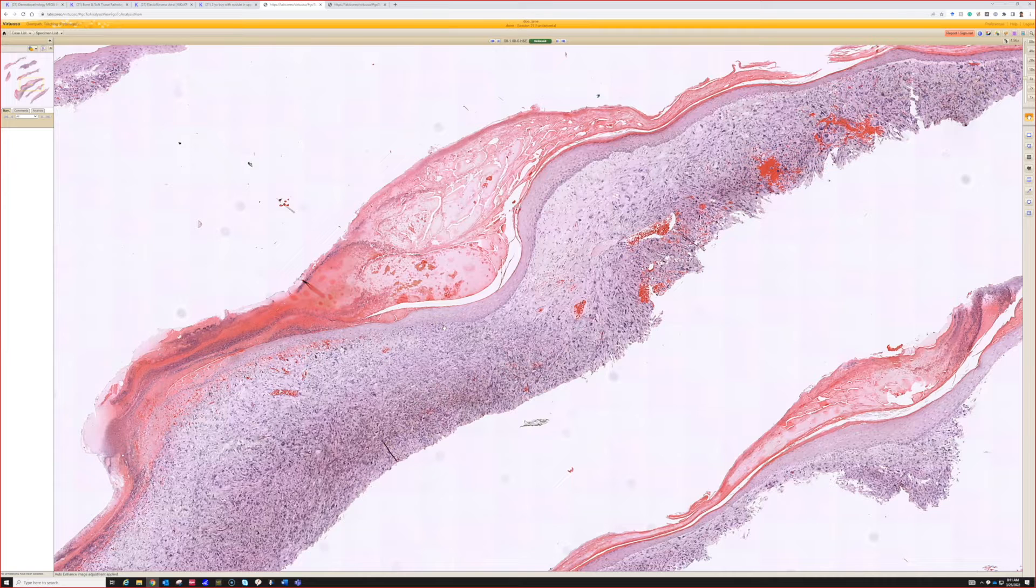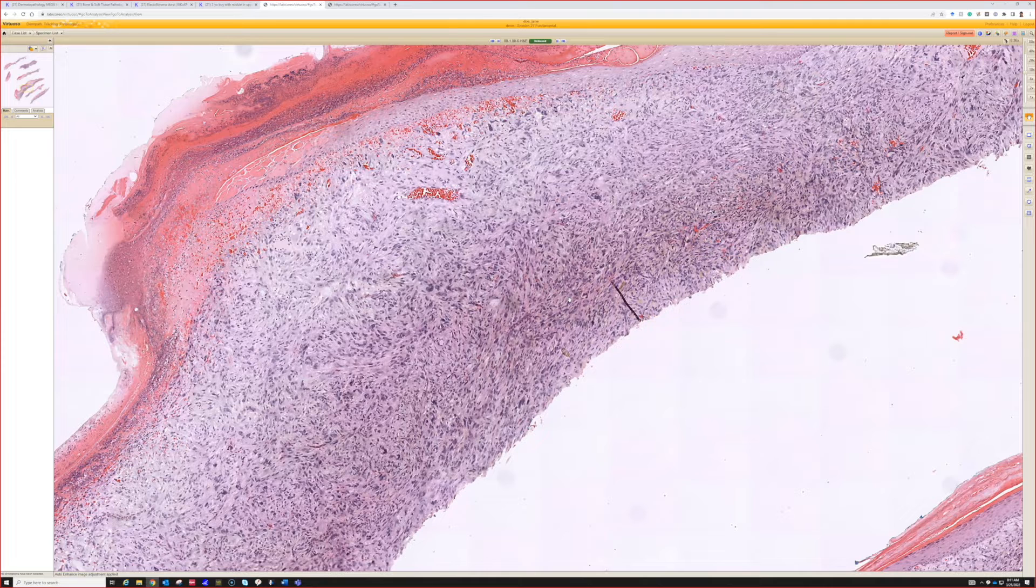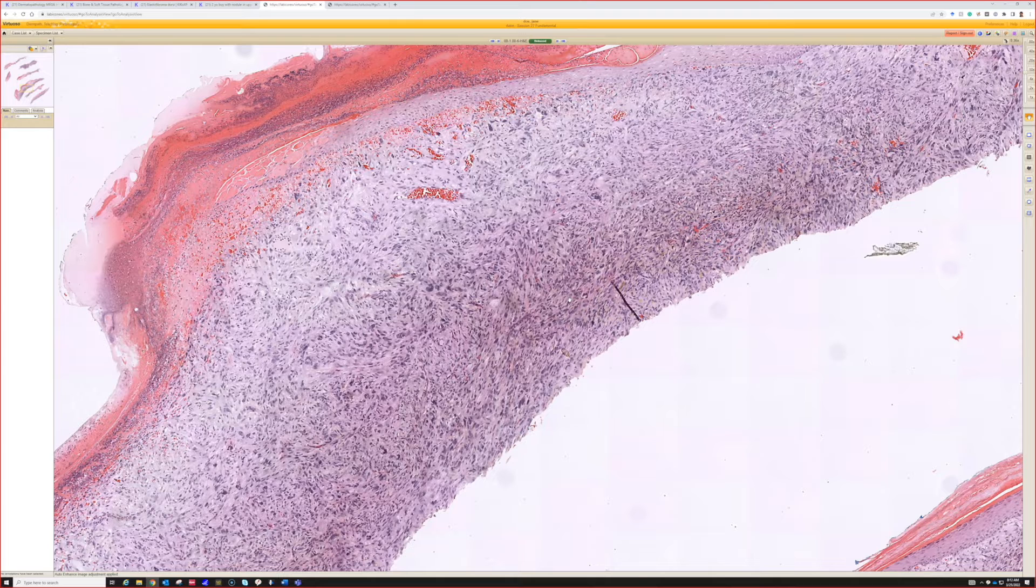If this were CD10 negative and all the other markers are negative, I'd still call it AFX versus PDS personally. Go ahead, Raheel. So you mentioned rhabdomyosarcoma in the differential. Yes. From where would rhabdomyosarcoma originate in the skin? Leiomyosarcoma arises from the blood vessels, so from where would rhabdomyosarcoma originate? Wouldn't it look more like the rhabdoid feature?